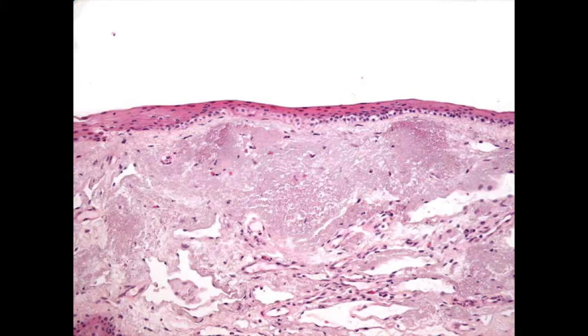Histopathologically, there's a lot of variation in the histology of pterygia. You tend to have, in some cases, actinic elastosis, increased vascularity, focal chronic inflammation. Actinic elastosis typically occurs in this area, and not all pterygia have it.